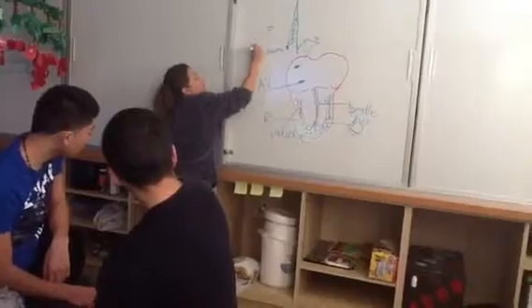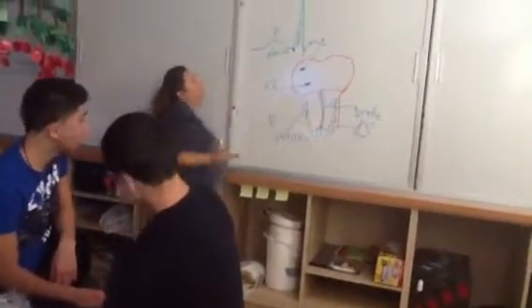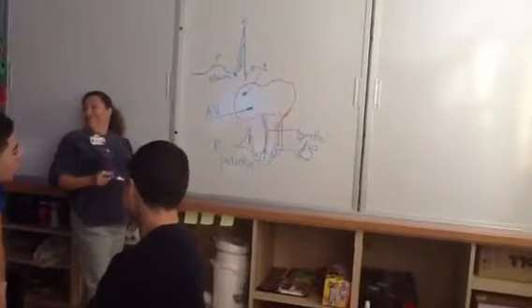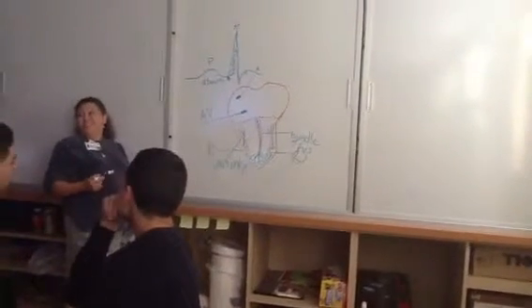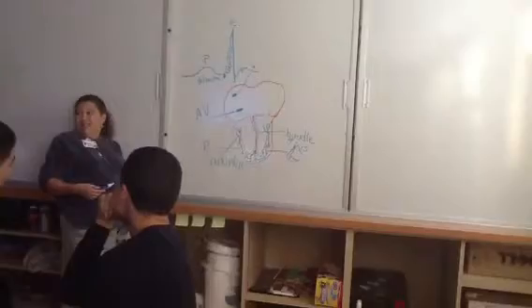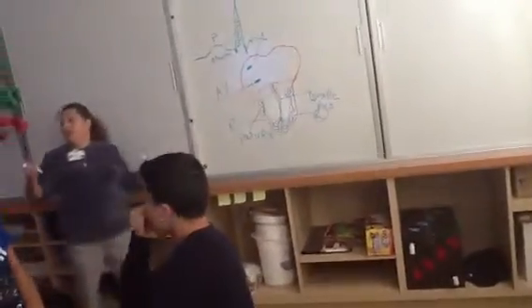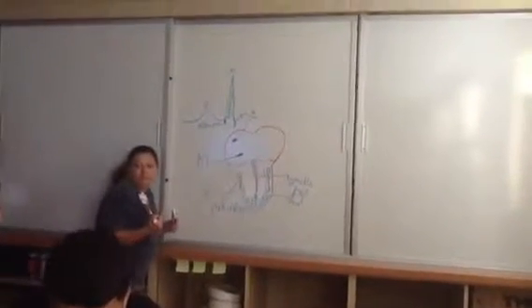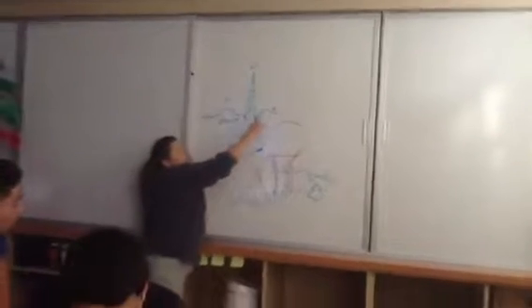So let's go back to normal. When it's relaxing at the ST segment, is it all happening at the same time? It's like half a second. Is the whole heart relaxing at once? Right, it's starting to relax. And what then is the little U? The little U is usually for older people, the collateral circulation, the extra. And then the T is when it's still relaxing. And that's your electrolyte.